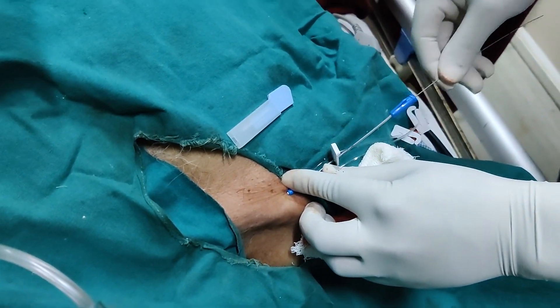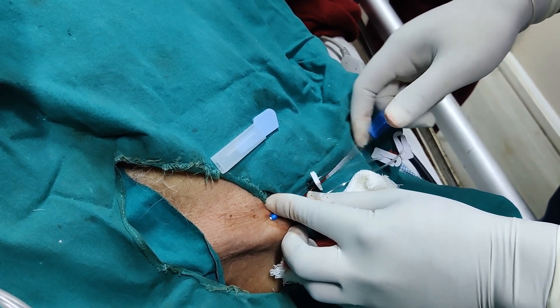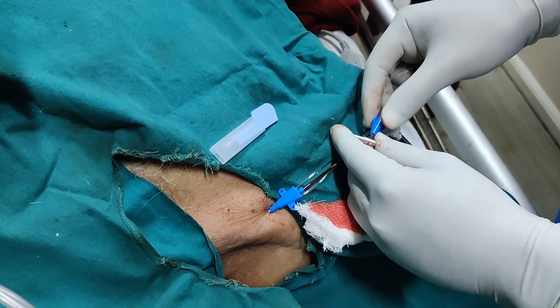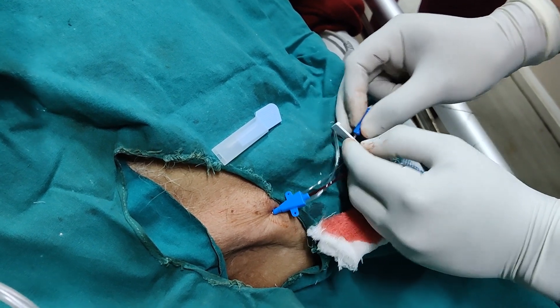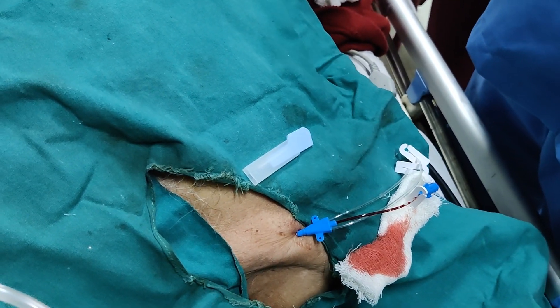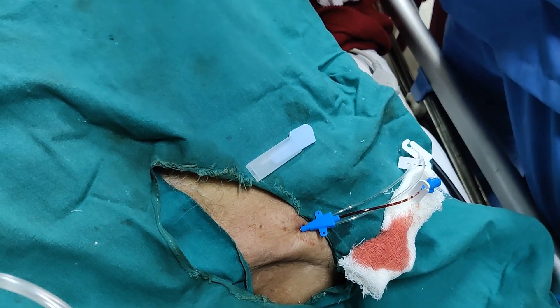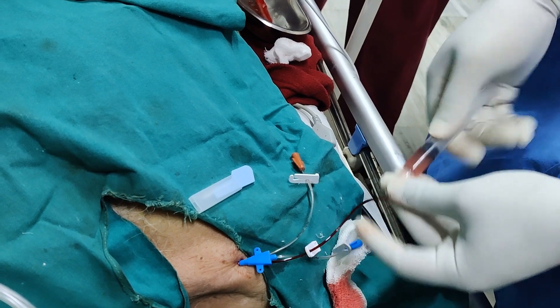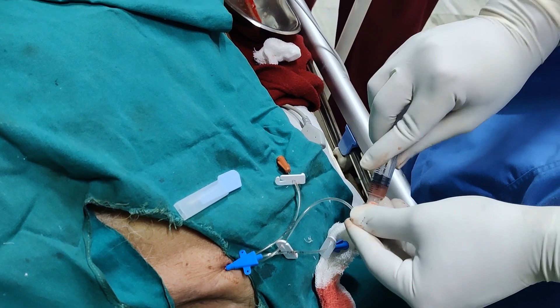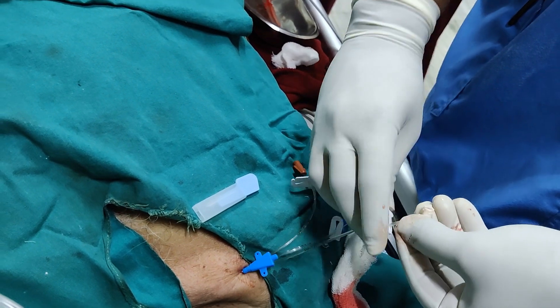Remove the guide wire by withdrawing it while holding the catheter securely in place at the skin surface. Then flush each catheter port with saline, draw any air from the line, and confirm venous blood flow into the hub.